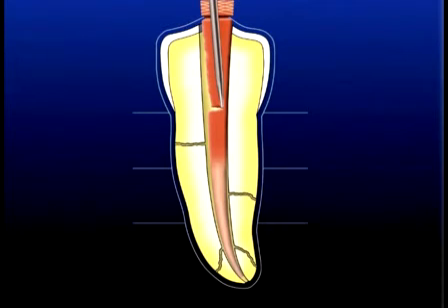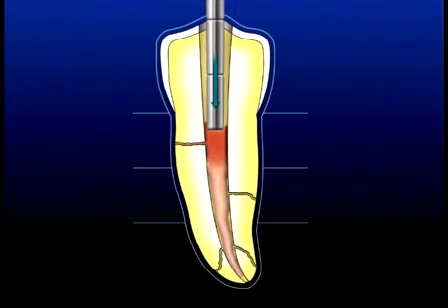The objective of this obturation technique is to progressively carry a wave of warm gutta percha along the length of the master cone, starting coronally and ending in apical corkage. The conductivity of heat generated through the master cone is about 4 to 5 millimeters. Compacting thermal-softened gutta percha apically moves this mass into the narrowing cross-sectional diameters of the preparation, creating the piston effect and enormous sealer hydraulics. This completes the first heating and compaction cycle.